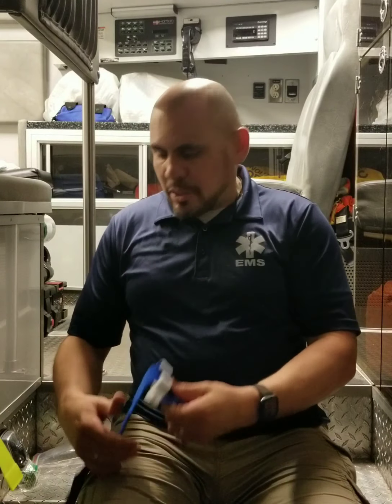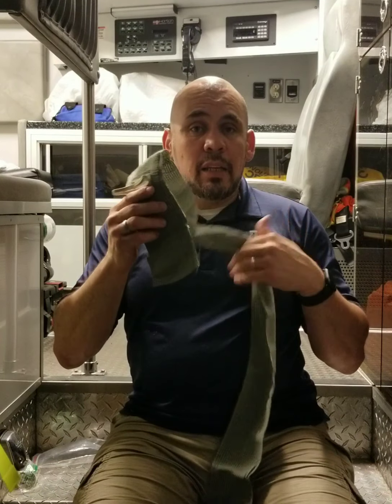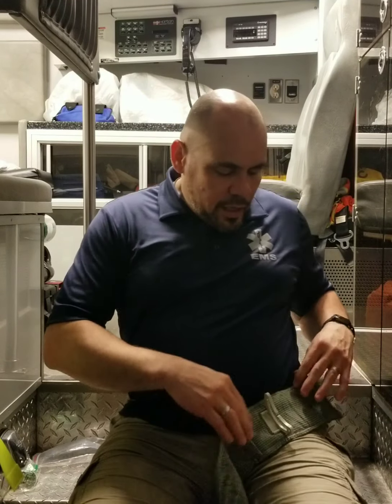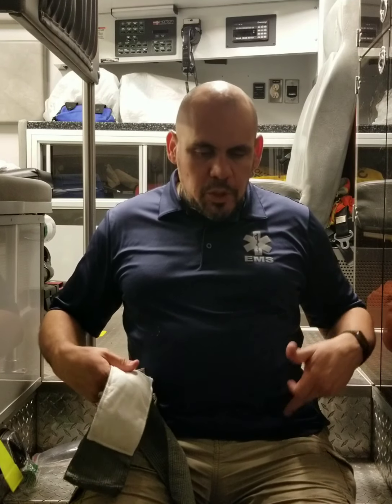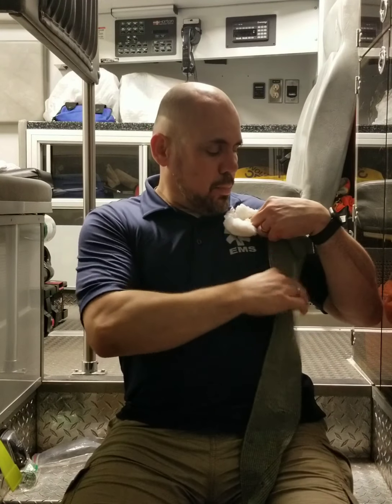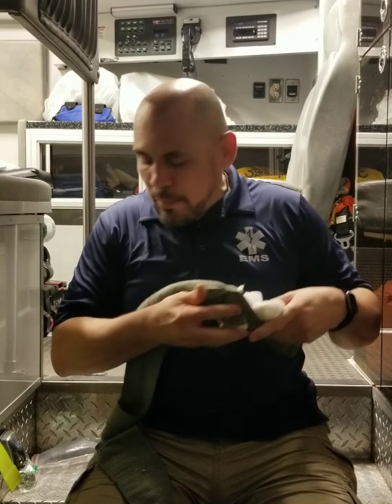Tourniquets, again, are for extremities, legs and arms. The pressure bandage or Israeli bandage, this pretty much works all over your body. Let's just say an abdomen, you can put that anywhere, in the back. If you have a wound, let's just say a puncture or a gunshot, at your junctures, in other words, where your joints are, where you can't put a tourniquet, you could use this. You could also do what's called wound packing. Take the gauze, a roll of compressed gauze, and really try to shove it in the hole. You're trying to force it in so it stops the bleeding. Then you wrap it around. That could go in the junctions of your legs, or it could be in the shoulder, same thing. I want to feed it through, cover it up, put pressure on it, wrap it around my shoulder, my back, whatever the case is, and stop the bleeding.